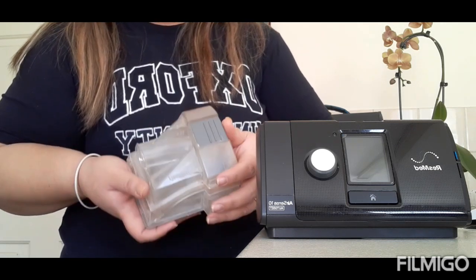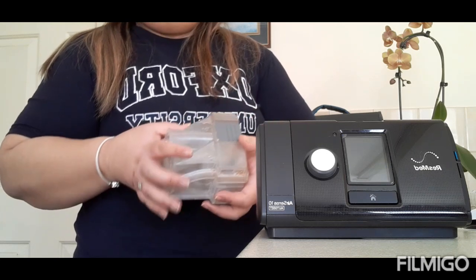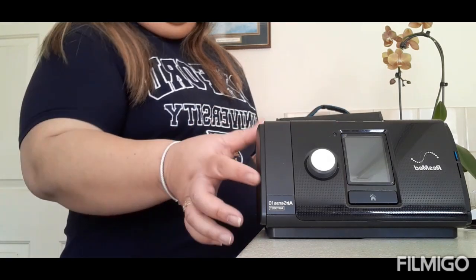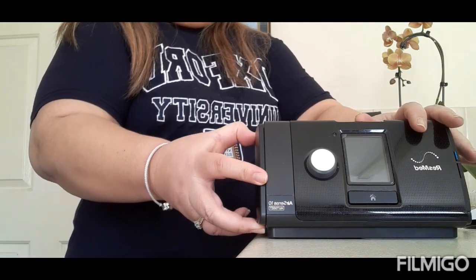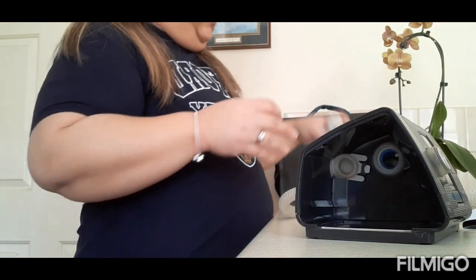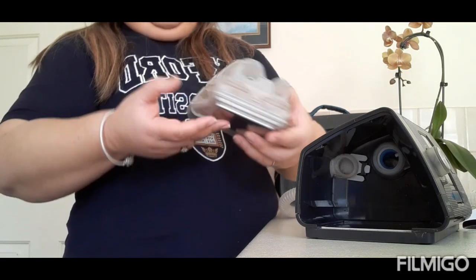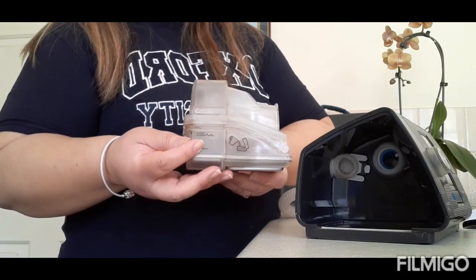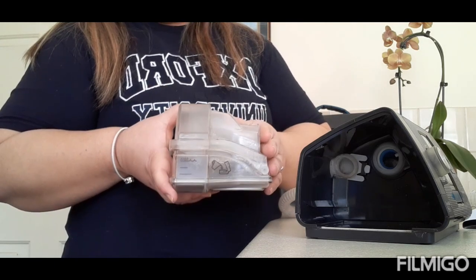As you can see, it's a bit dirty now, it's because I'm using it. And you have to put water in it, and then you can put it in the side here. There's a slot in here. There you go, guys. And then you put water in your humidifier, wherein you can see the instructions in there, how much water you can use. As you can see, it's already got limescale because I've been using water in it.